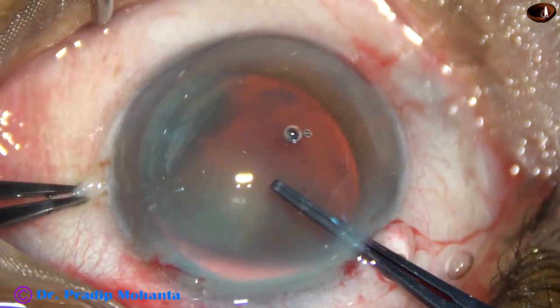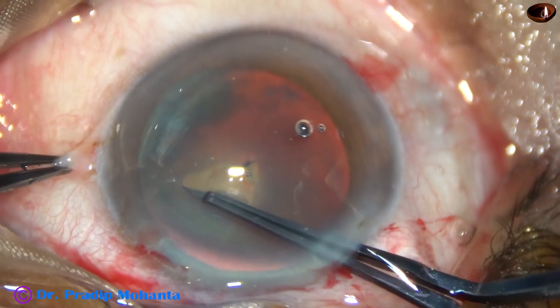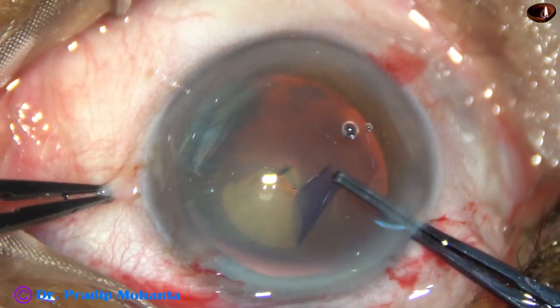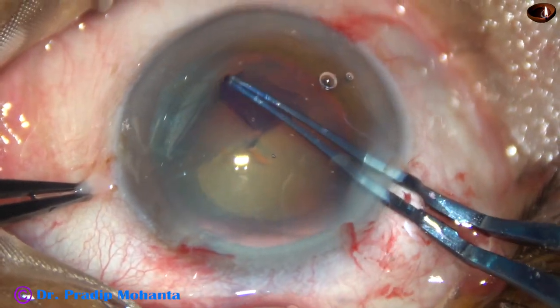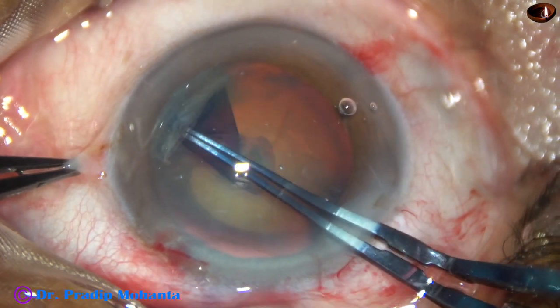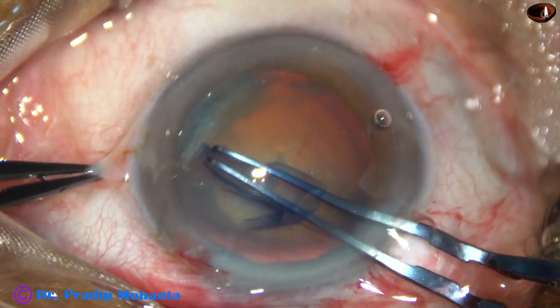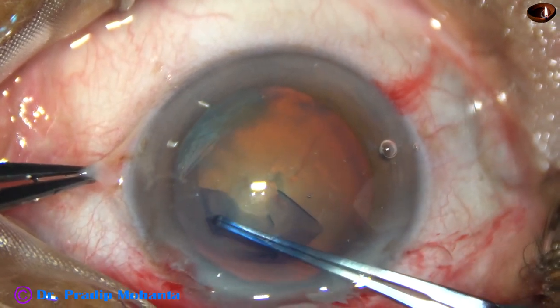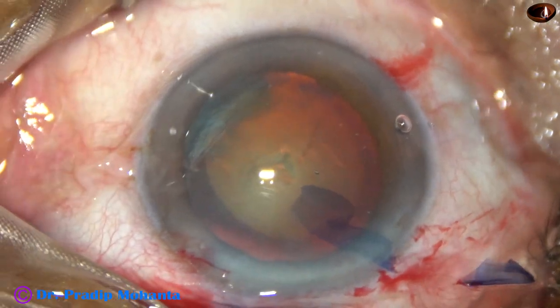Now capsulorhexis. A cystitome forceps is taken. The anterior capsule is punctured. A capsular tag is raised. And now the capsular tag is guided in such a way that it remains at a certain distance away from the margin of the dilated pupil. And thus, a fairly round, adequate-sized capsulorhexis is obtained. This is a continuous curvilinear capsulorrhexis.